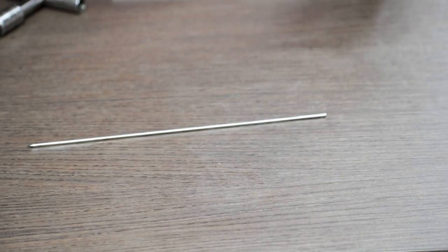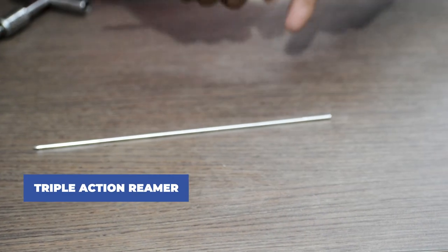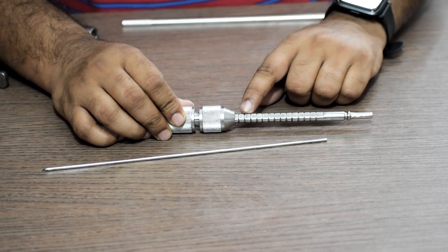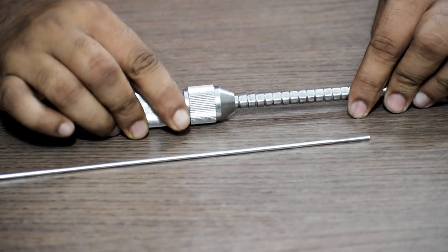Once the measurement is done, we will take a triple action reamer and set the reamer to the exact length that we have measured using the measuring scale. As you can see here, a demarcation of the length.